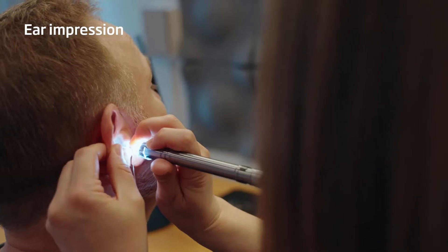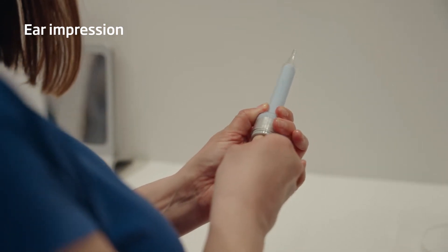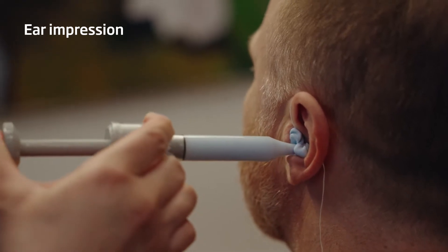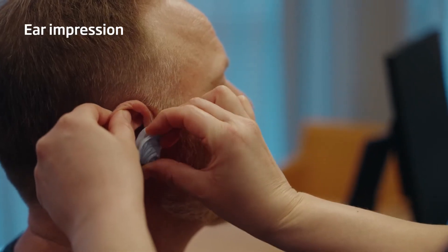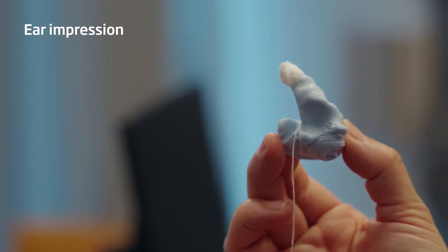First of all, there's the ear impression. All custom hearing aids start with an optimal impression of the ear. The ear impression is the foundation of a good custom fitting, and the importance of a good ear impression cannot be overemphasized. In order to get the most accurate fit of the custom device, each impression should be carefully examined before sending it.